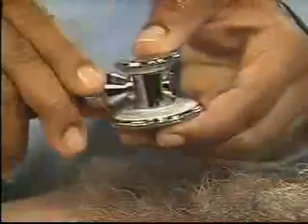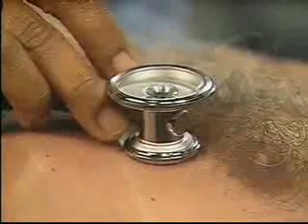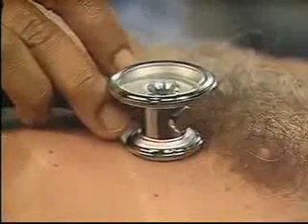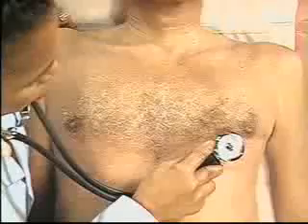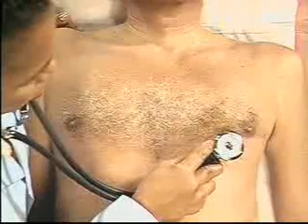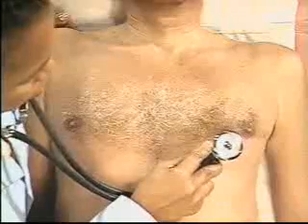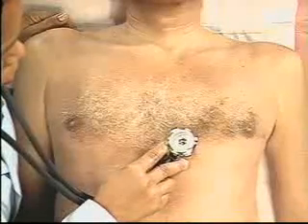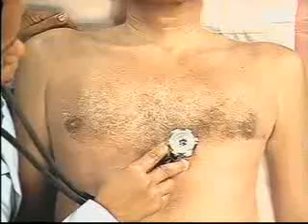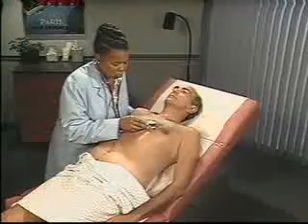Now switch to the bell of the stethoscope, which is more sensitive to low-pitched sounds such as S3, S4, and the murmur of mitral stenosis. Listen at the apex again, then in the fifth interspace, and in the fourth interspace.